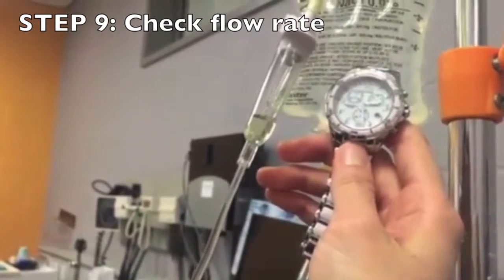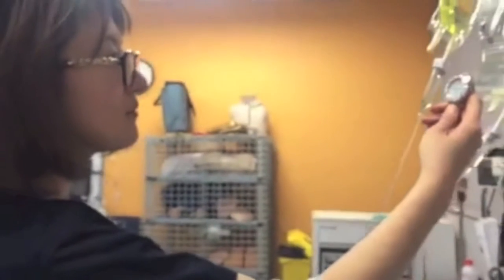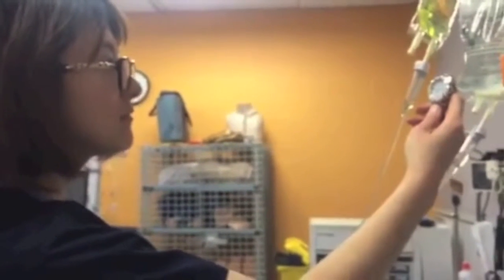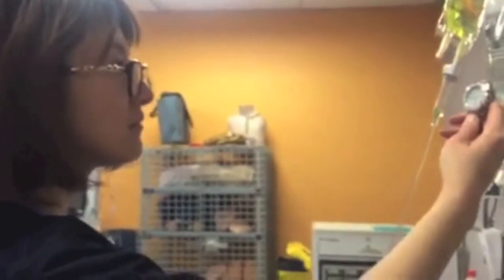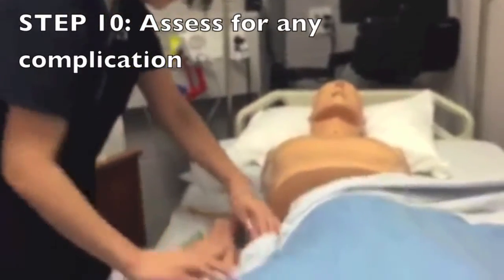Establish the flow rate by counting drops in the drip chamber for 1 minute by watch. Then adjust the roller clamp to increase or decrease the rate of infusion. Assess for any complication.